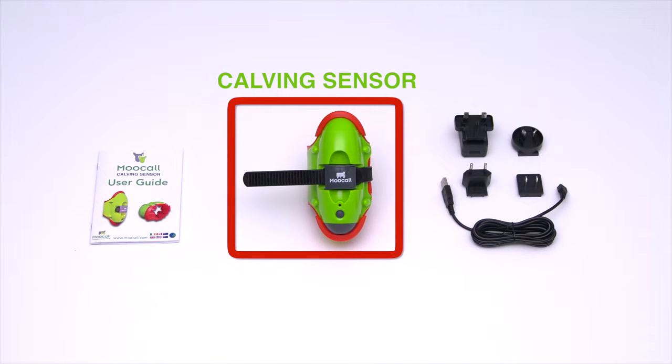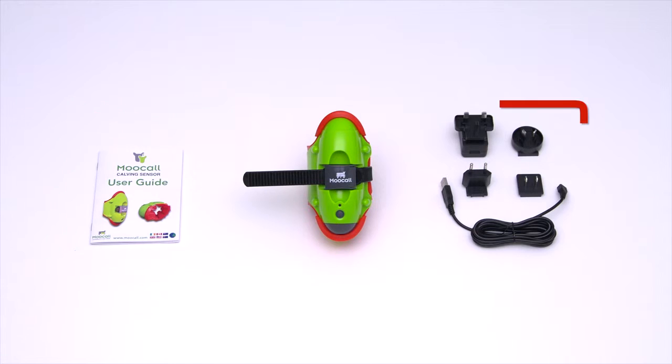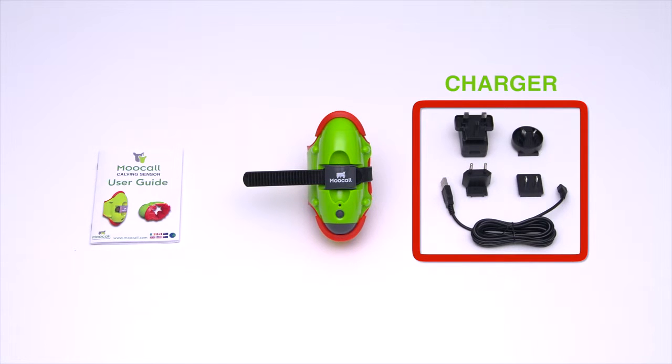Inside, you'll find the Moocall calving sensor, a user guide and a universal battery charger with regional adapters.